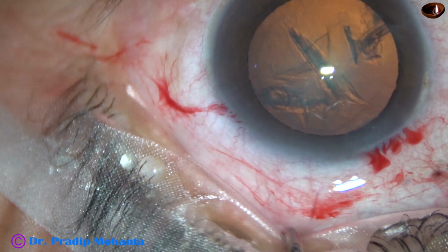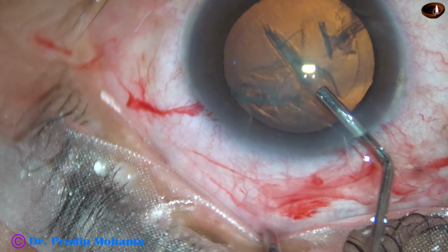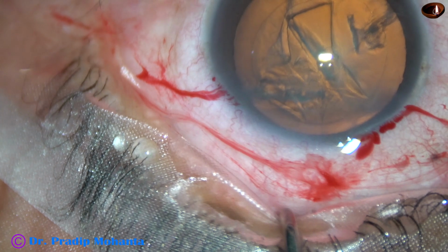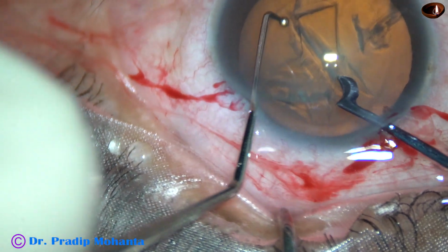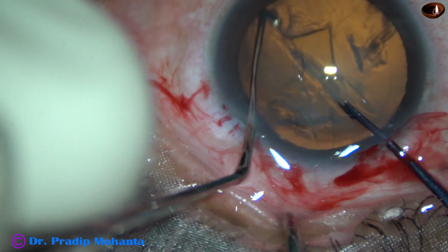And now I'm going to use a pre-chopper. Again, some more visco. Now let us pre-chop this nucleus. In my left hand is Akahoshi's sustainer, and in my right hand is Suhail's pre-chopper.